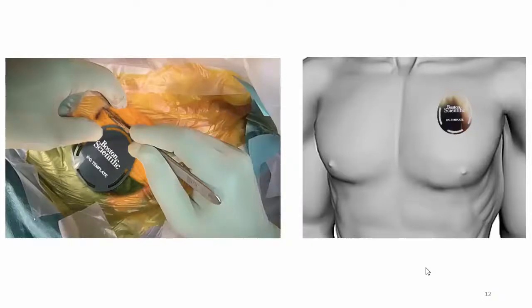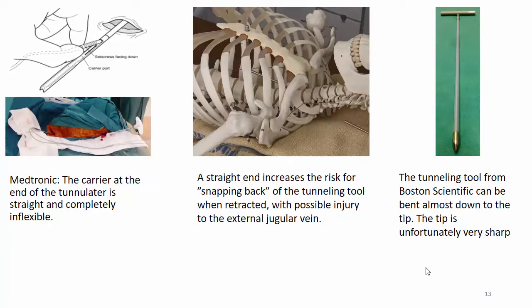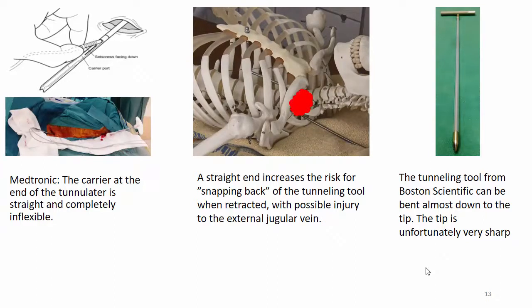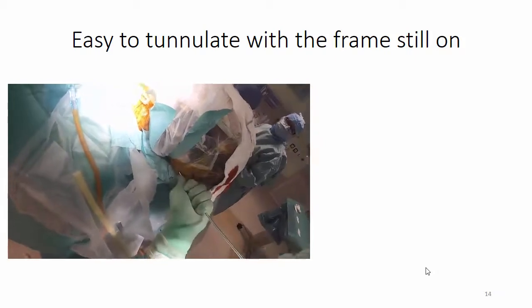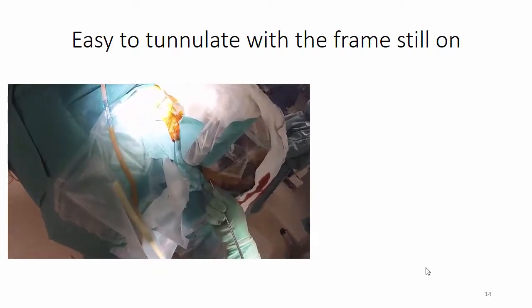Regarding the IPG pocket on the chest, you can estimate the size of the incision and pocket by using the template. It is time for the tunnelation. With Medtronic, the carrier at the end of the tunnelator is straight and completely inflexible. A straight end increases the risk of snapping back of the tunneling tool when retracted, with possible injury to the external jugular vein. The tunneling tool from Boston Scientific can be bent almost down to the tip, though the tip is unfortunately very sharp, and I prefer to use a similar model that is less sharp. With a tunnelation tool that can be shaped as desired, it is easy to perform the tunnelation without removing the stereotactic frame, as seen here, which saves a lot of time. A plastic tube is placed over the tunnelation tool before tunnelation and then left in place when the tunnelation tool is retracted.